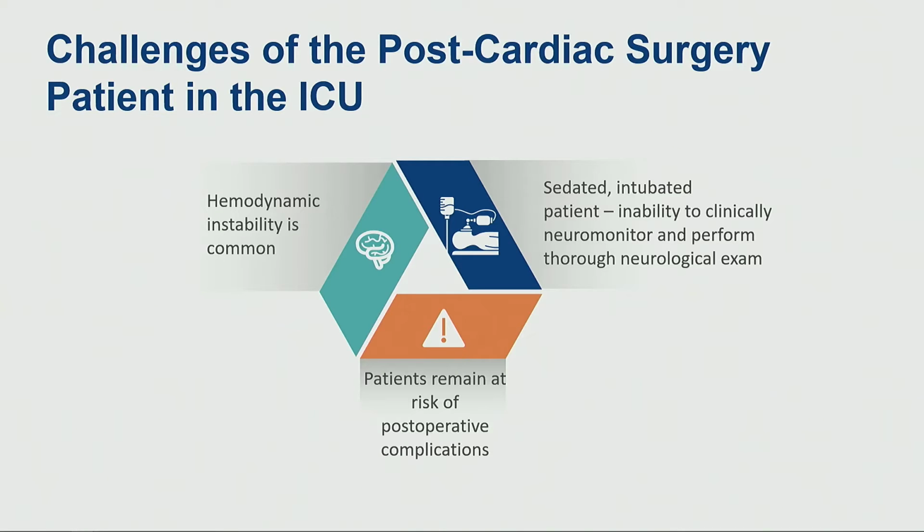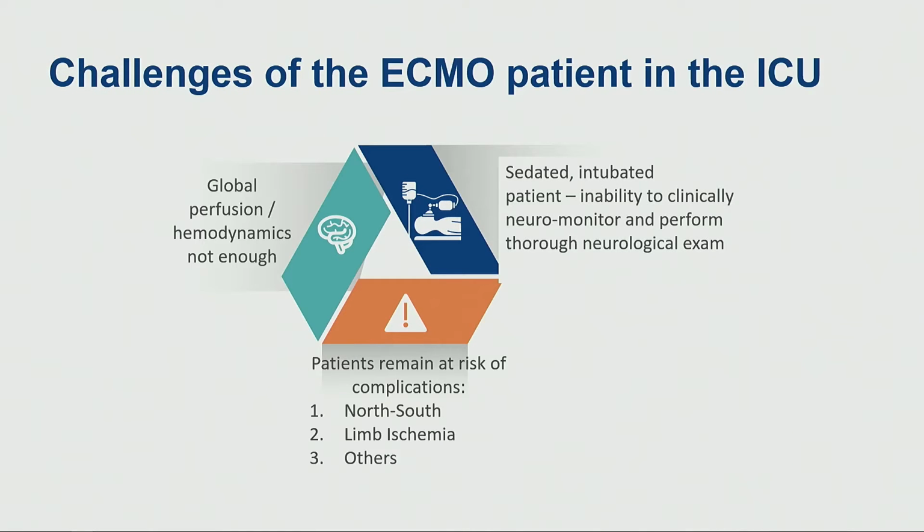Now, what are the challenges of monitoring a post-cardiac surgical patient? And I'm going to flip to an ECMO patient as well. Some common sense issues, right? They are at least initially intubated, sedated, so it's difficult to perform a clean and thorough neurological exam. Hemodynamic instability is common in the cardiac surgical population, and overall risk of postoperative complications and organ system failure is fairly high.